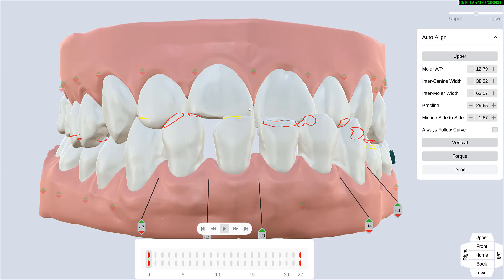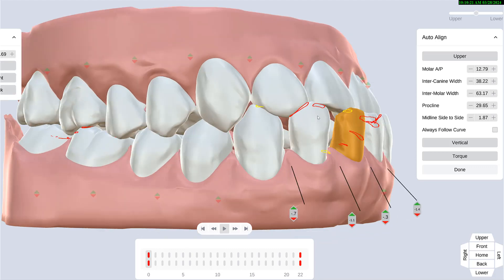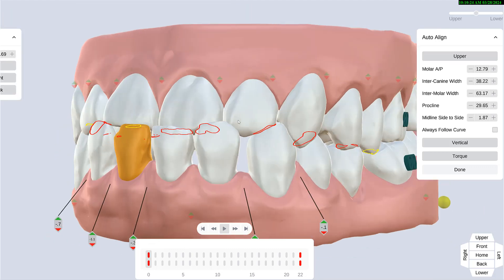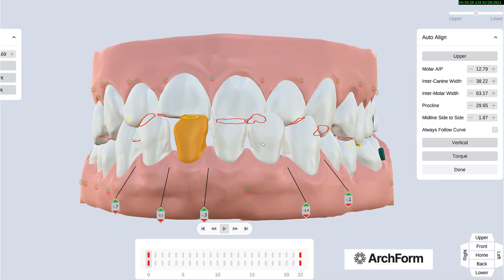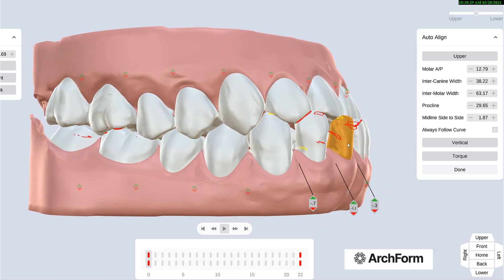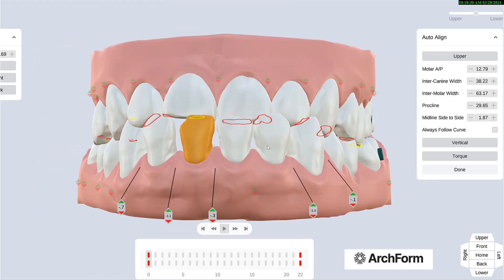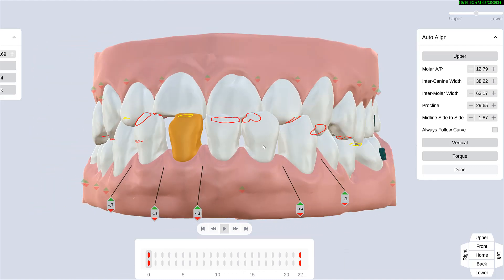Today I'm presenting a case that has been uploaded into the ArchForm software to illustrate the new trends in aligners done by uLabs, ArchForm, Titan, and obviously Invisalign, where they have the auto-align option.